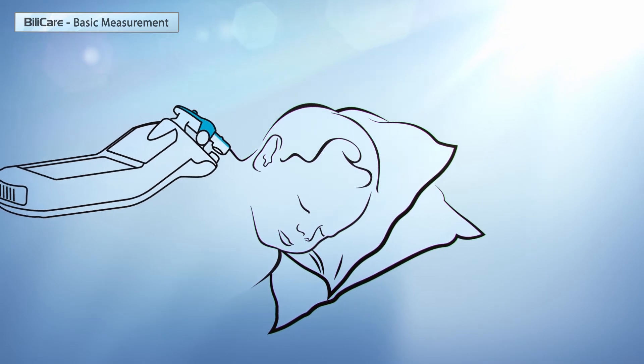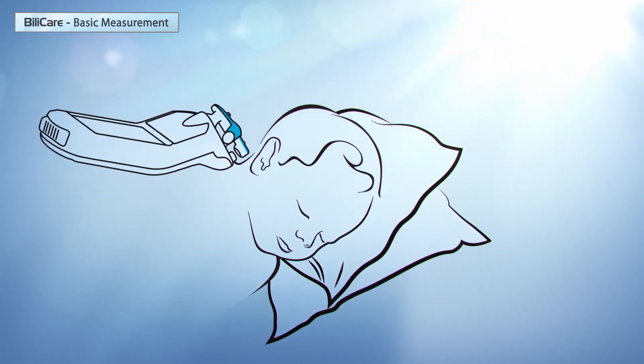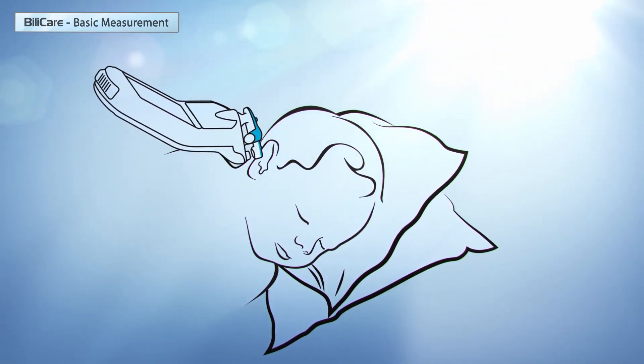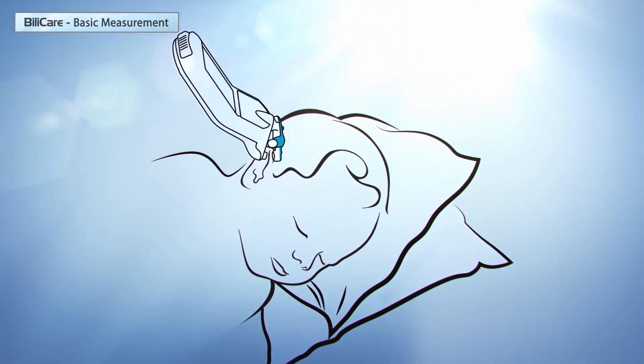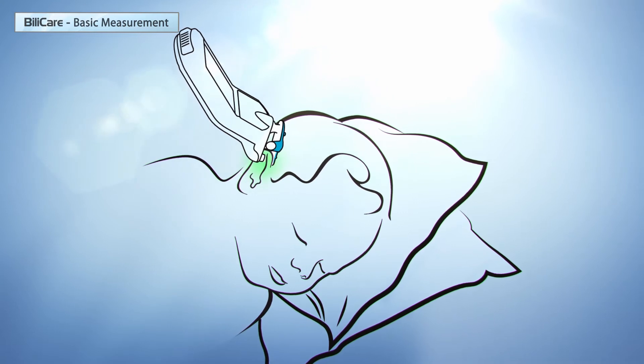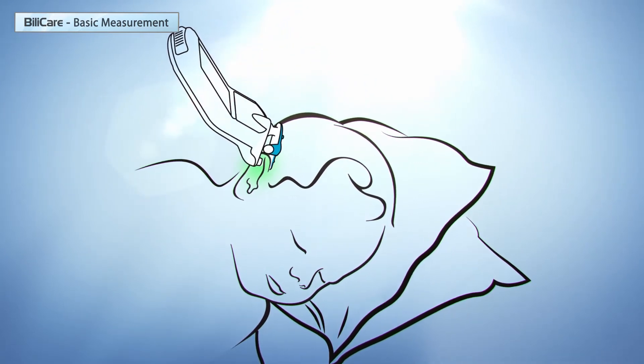The blue part of the clip should be positioned close to the head. Once the BILICARE is near the baby's ear, press on the clip's lever. Do not place your index finger on the clip until you are near the baby's ear and ready to place the clip on the ear.